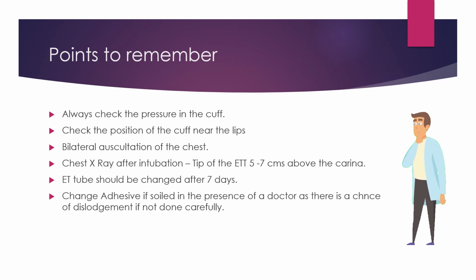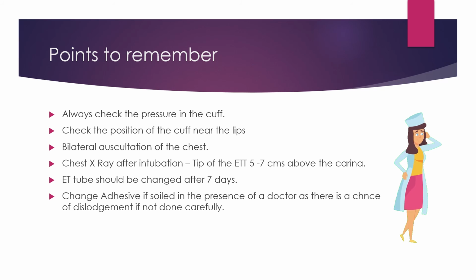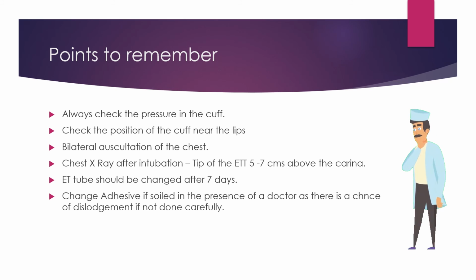Okay, then post intubation, always a chest x-ray is demanded by the ICU intensivist or the anesthetist. That is because they want to check where the tip of the endotracheal tube lies, and it could be around 5 to 7 centimeters above the carina. Okay, and as per infection control, the endotracheal tube should be changed after 7 days. This is done by the anesthetist, so you have to be around and keep things ready.